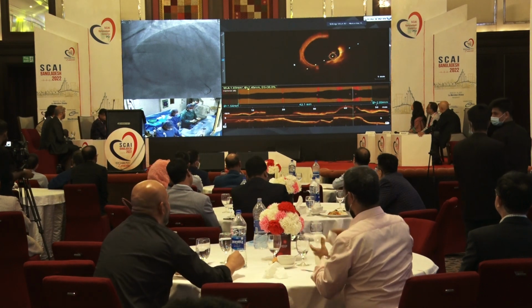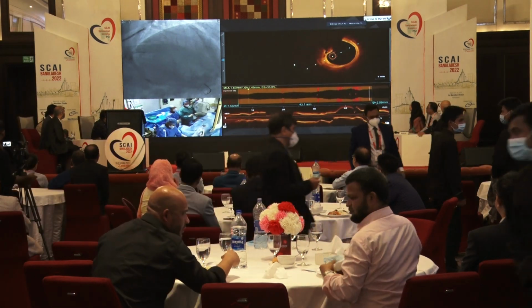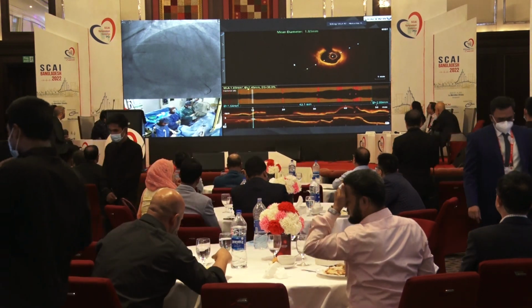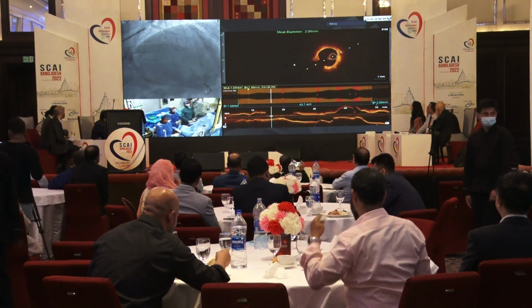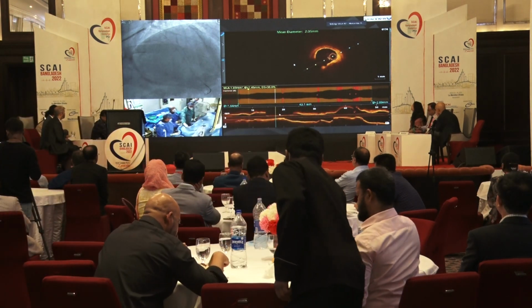So talking about this OCT, I think that we had some good news. The OCT machine recording is okay, it's acceptable. So we start distally. Can you see the OCT? We can see it. Okay.